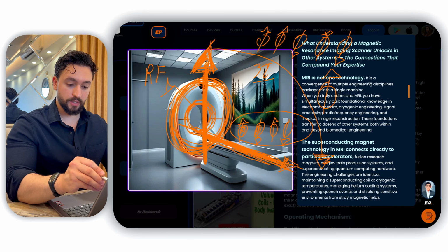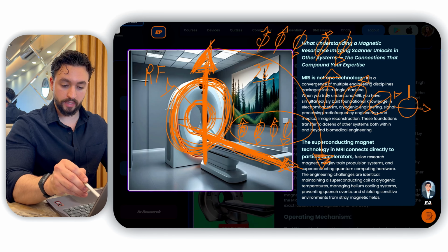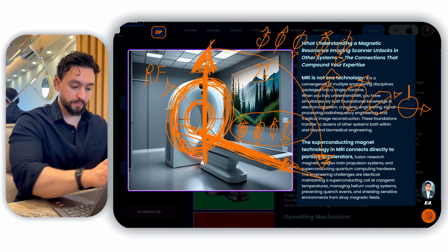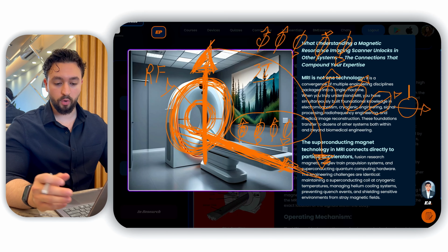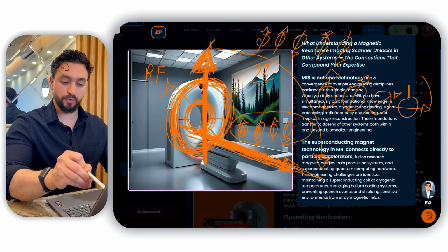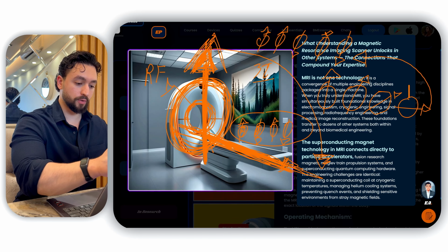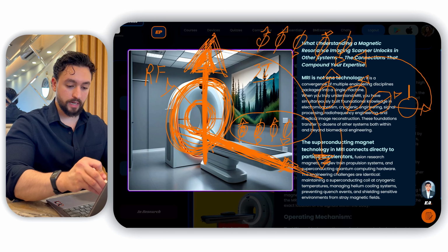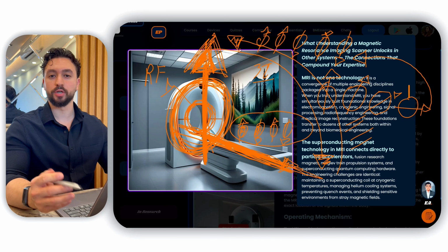So it was previously like this, now it is going to look like this, and then it is going to look like this, and then finally it looks like this, which is perpendicular to the patient positioning, as you can see over here. And then the RF pulse is cut or stopped or shut, and then these will have to return back to the original position, which is the position over here. And in this time going back to the original position, we get echoes, which are the signals.